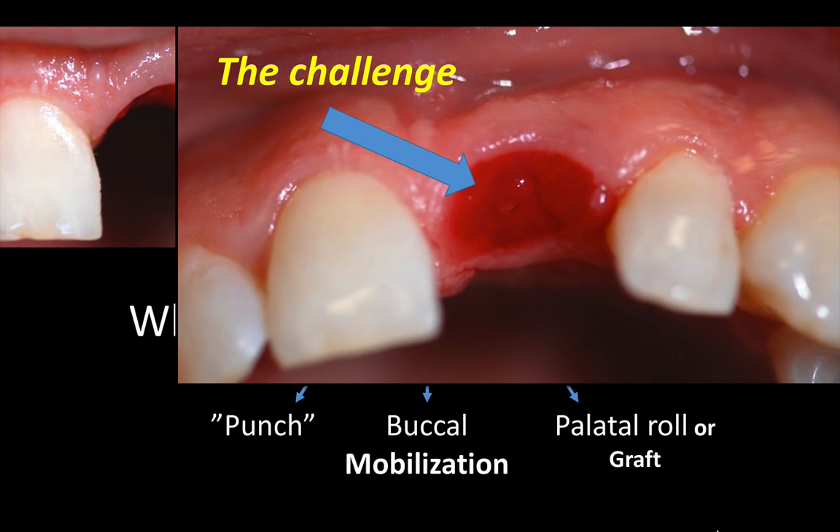We can also resort to connective tissue grafting, and we need to find a way to have a patient with a tooth in place without touching the ridge. So it really adds to the complexity of this case. Considering all options, looking at the patient's smile line, and weighing the pros and cons, possible risks, complications, and cost, I felt it was reasonable to choose the punch approach — and in that way, uncover the implant, removing all this hyperemic tissue immediately, and shorten the treatment time. And I know for a fact that this approach will not compromise the papilla, which is very critical in every aesthetic case.